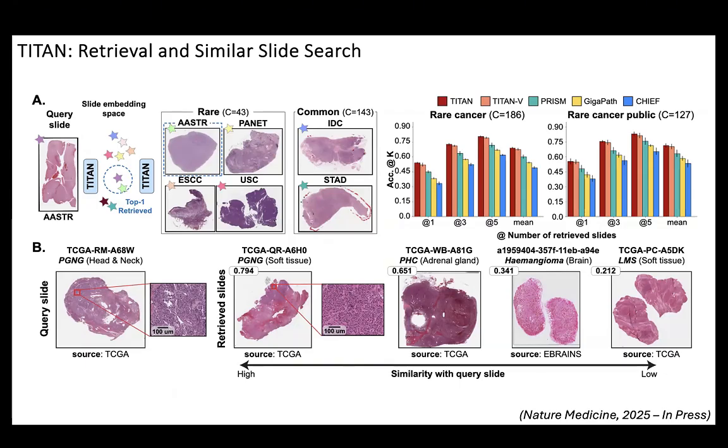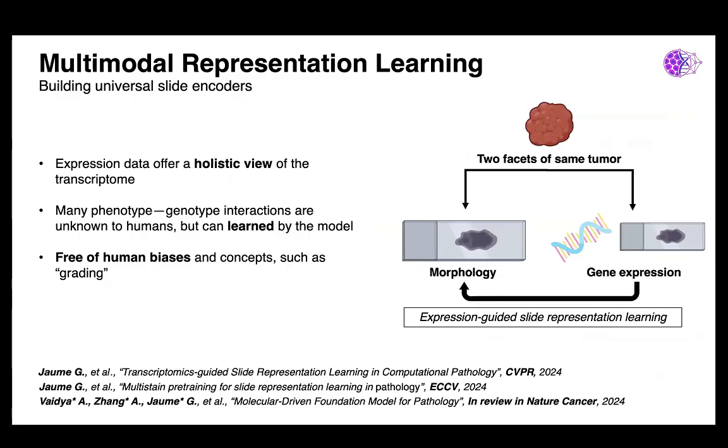So we've been effectively doing this anyways to discover new features as well. So how discovery happens for pathology images today: because most hospitals are still not digital, people are looking at glass slides under a microscope. They will look at lots of glass slides under a microscope, find a common morphologic feature, correlate it out, and we can do that computationally using slide level representations.